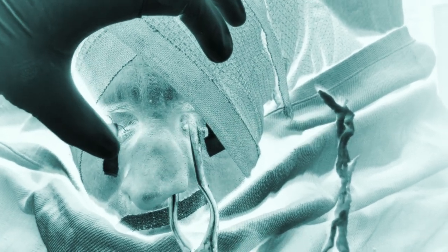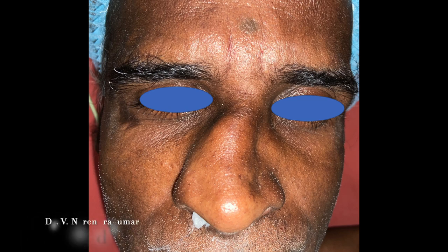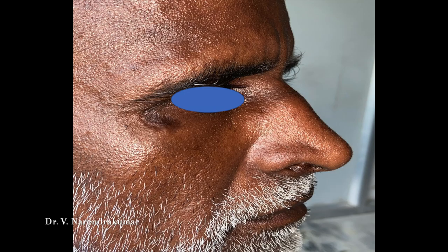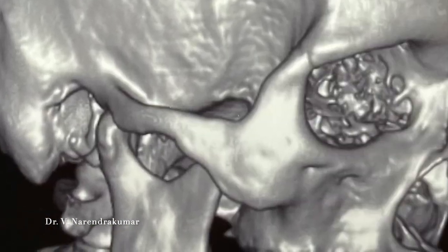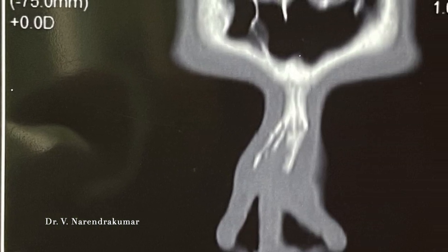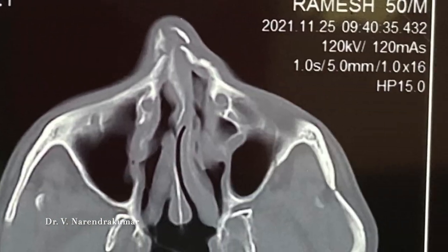A 50-year-old male had a road traffic accident, following which both nasal bone fractures occurred. This is a clinical picture after seven days of the RTA. Computerized tomography of the paranasal sinuses was taken, confirming the finding of bilateral nasal bone fracture.